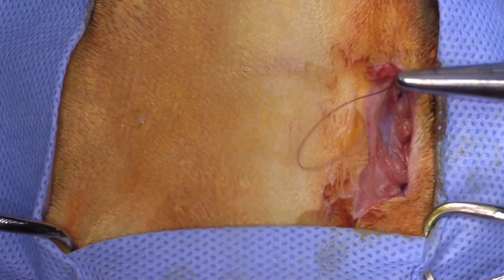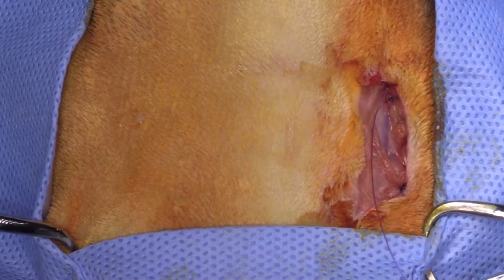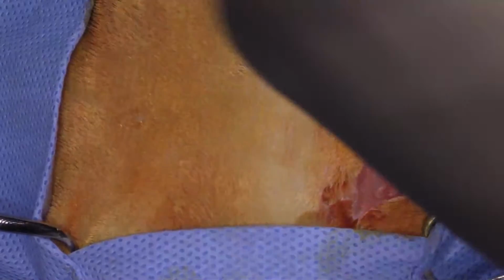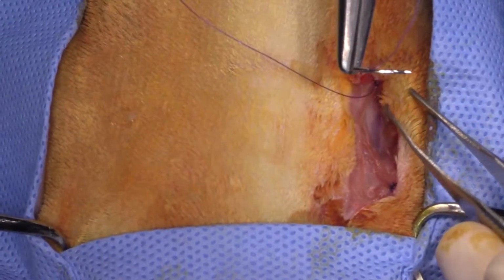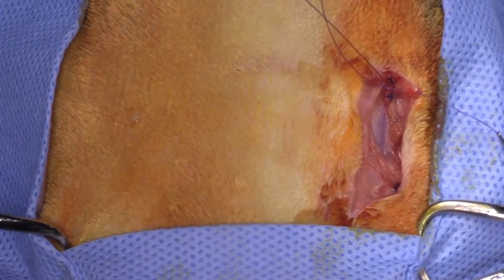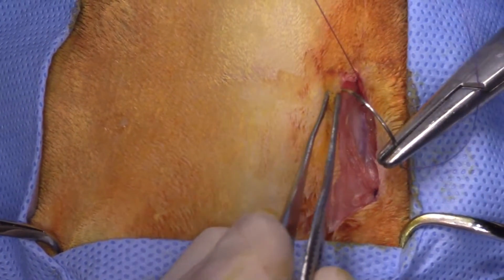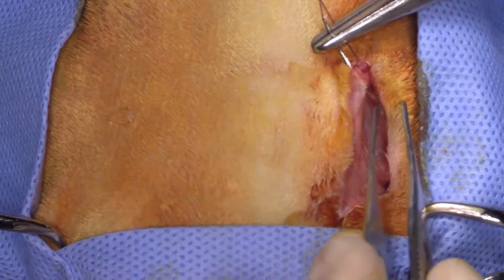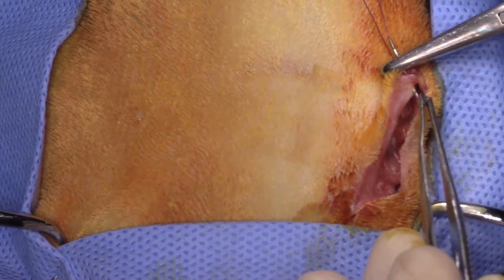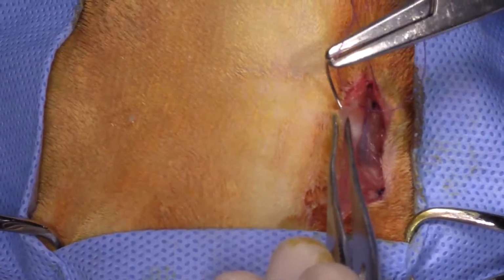Yes, please. 2-7 long 30 degree. Thank you, unless they need it for something else. Okay, so just retract on that for me, please. So you can see that it's not too long a procedure as long as you don't get lost. If you get lost, it could be pretty frustrating and daunting.